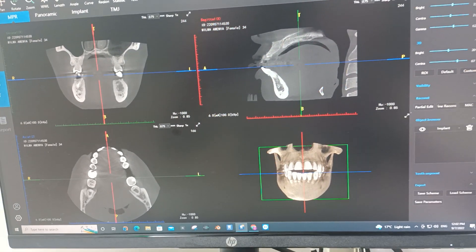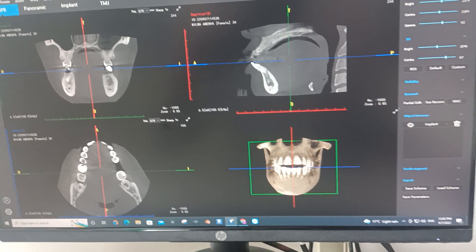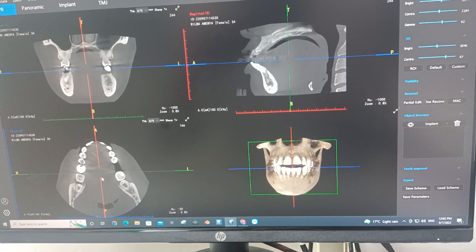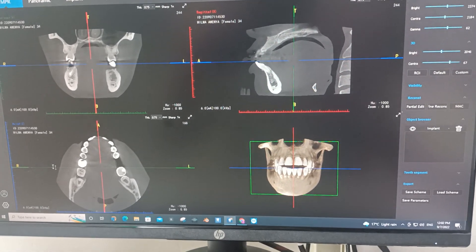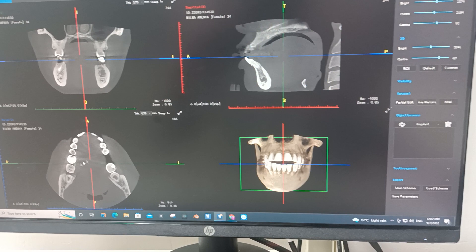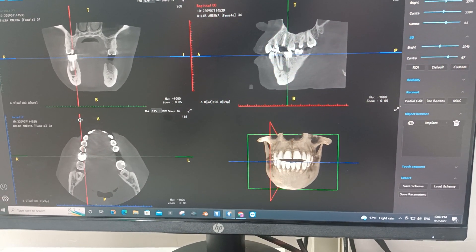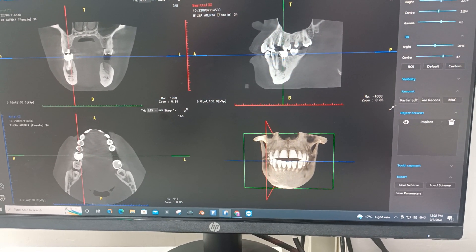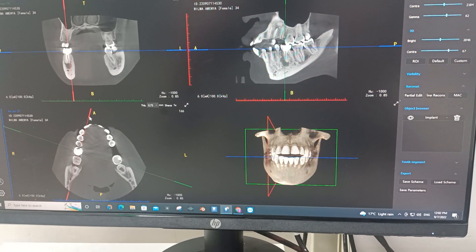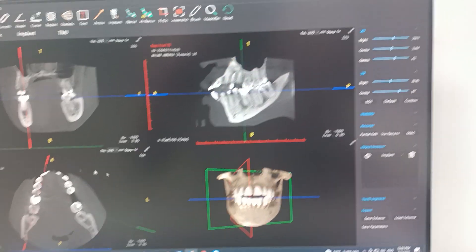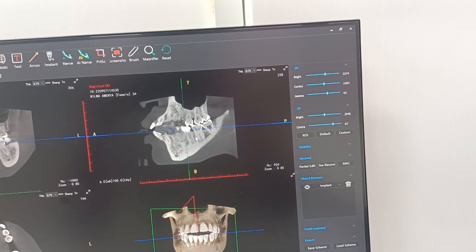So that's an image of the CBCT we've taken of the patient. It appears in four views: there's a coronal, there's a sagittal, there's an axial view. We can actually come here and drag this crosshair, and then with the red one you can actually rotate it. Notice what happens to this as you do so.